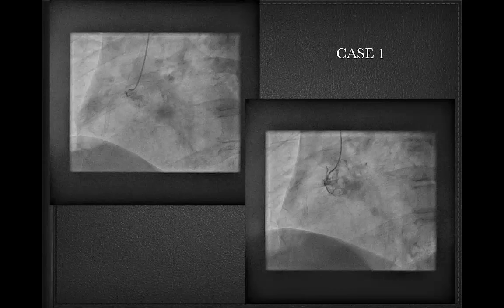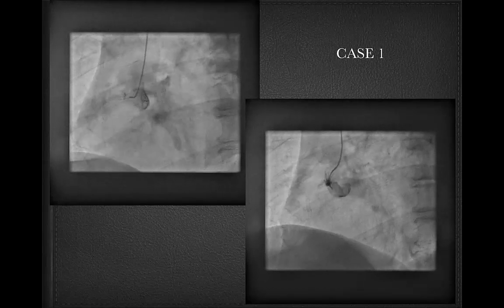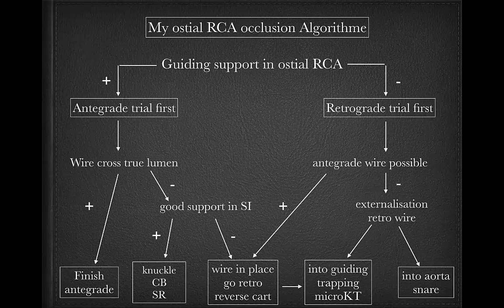So the best projection we can have is this one.